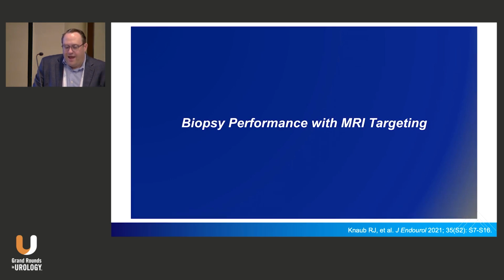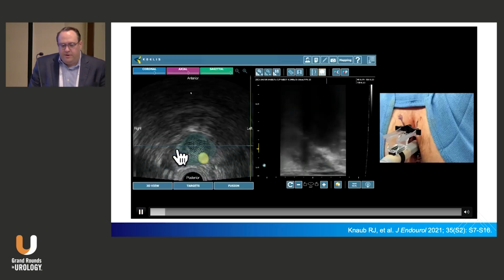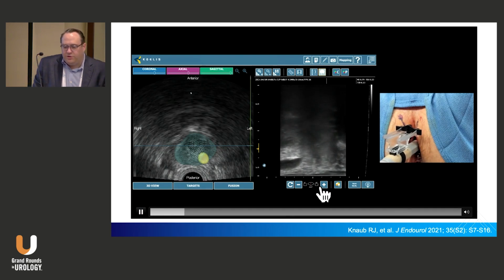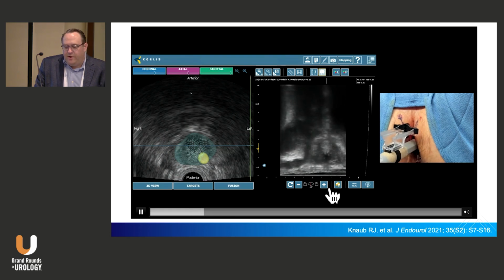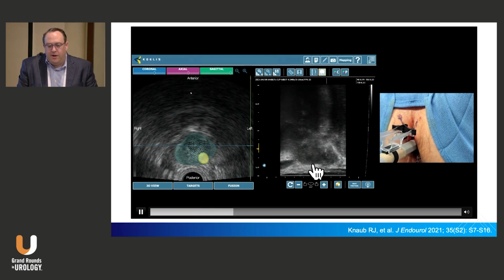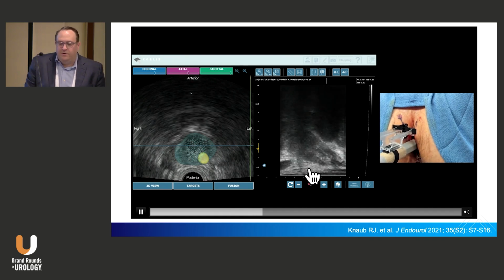And then through that access point, I'm then able to biopsy the whole either left or right side of the prostate. And what this video is very simply showing is, if you look at the central portion here with the live ultrasound, I'm simply lining up with where I think my lesion is. I take an updated reference ultrasound. If the image is indeed aligned with the target, I'll then see it appear here, and then I just simply pass my needle in, fire, and collect my tissue.